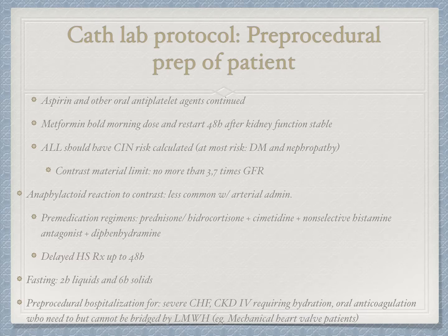Preparation of the patient. Aspirin and other oral antiplatelets, don't stop them. If the patient is on metformin, don't give the morning dose, and hold it until 48 hours after kidney function stabilization. All patients should be assessed for the risk of contrast-induced nephropathy.